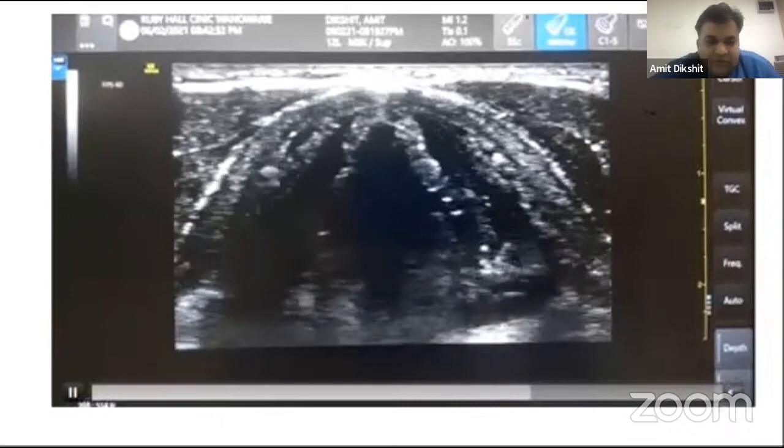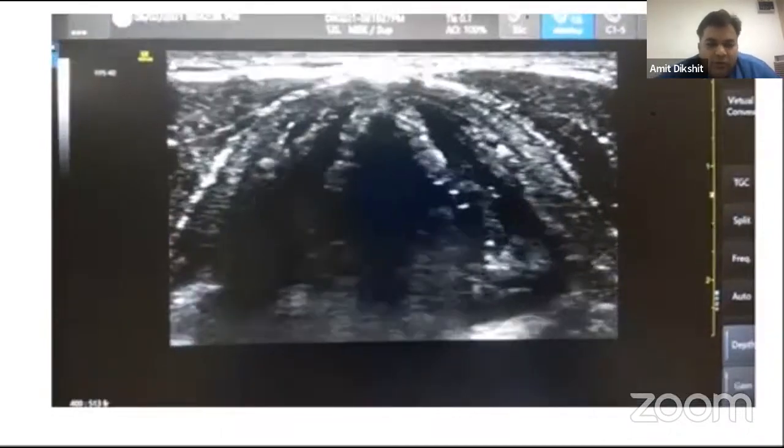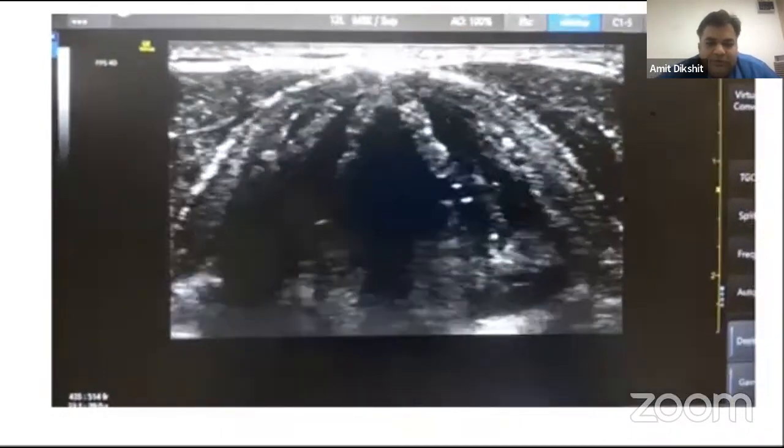So in thyroid surgery, it is a good idea to use Bailey's maneuver. Some of you may know Bailey's maneuver, where the ET tube is removed and we just place an LMA, and then after placing the LMA, we can see the movement of vocal cords very well.